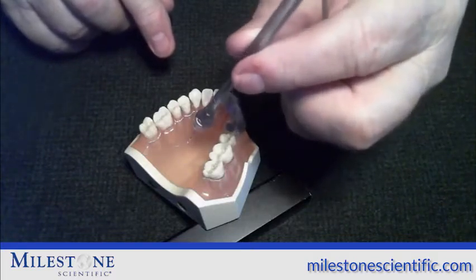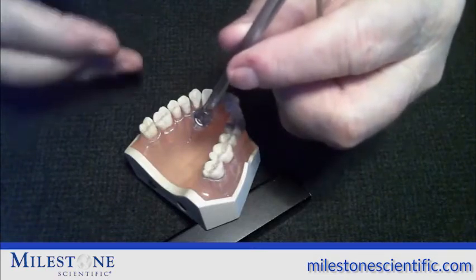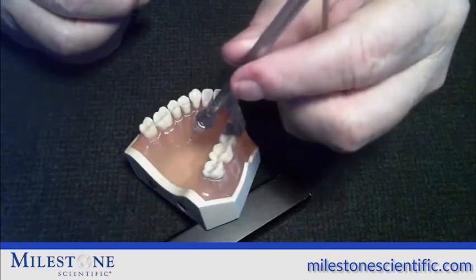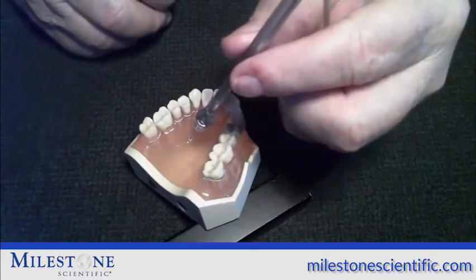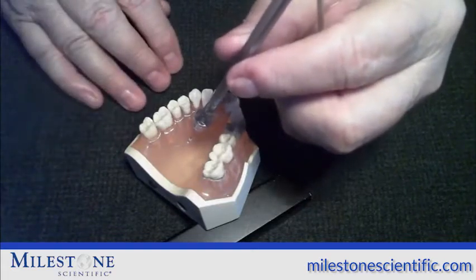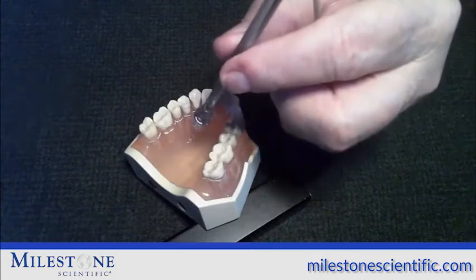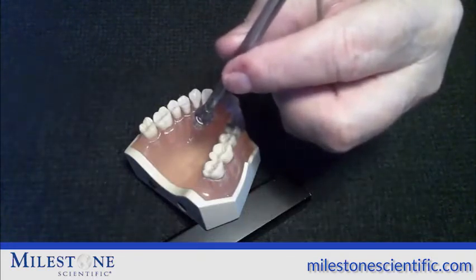It may take eight, ten, or twelve seconds to hit the bone. We have an anesthetic pathway — we know exactly how much anesthetic is coming out of that needle: one drop every two seconds. So if we move the needle through the tissue very slowly through a pre-anesthetized tissue, the patient won't feel the penetration. When we hit the bone, we're in the third stage of the injection, which is the easiest stage because the instrument is doing all the work. All we do is hold the needle in place and allow the anesthetic to flow throughout the palatal area — you'll see ischemia. How much do we deliver depends on the drug and the patient. If we're using lidocaine on an adult patient, deliver a full cartridge of anesthetic. If we're using articaine, use no more than one half of a cartridge. If we are working on a child, those dosages should be cut in half.